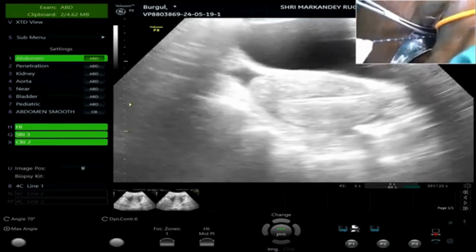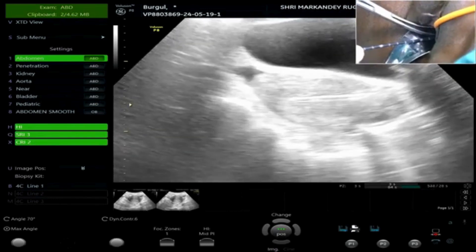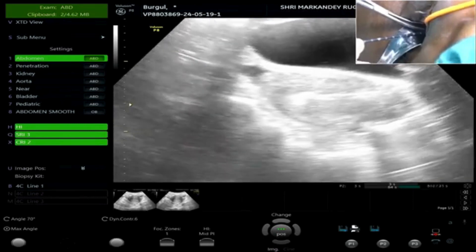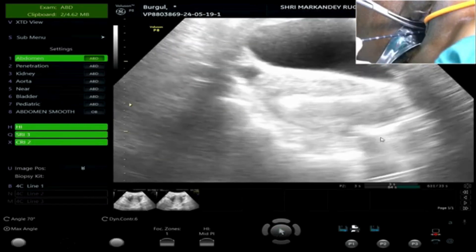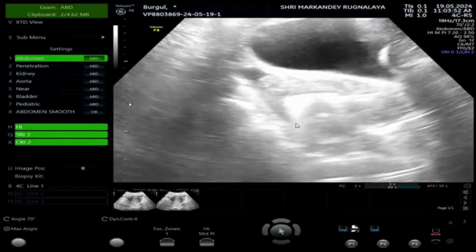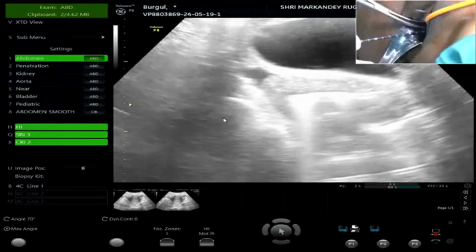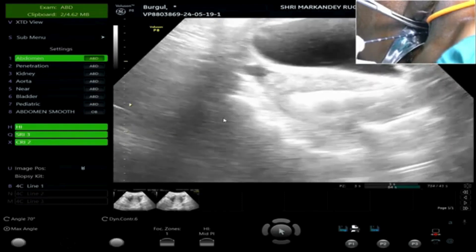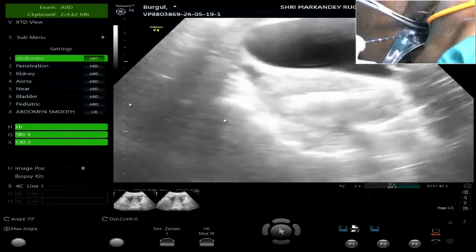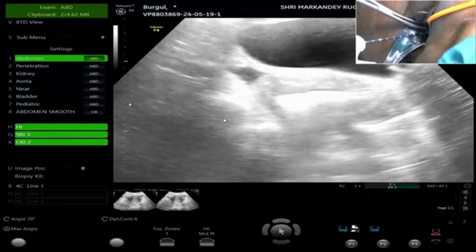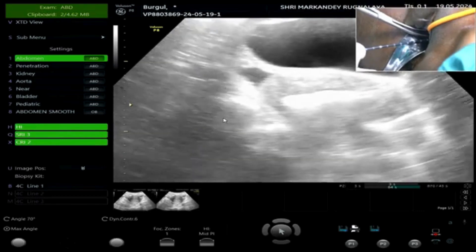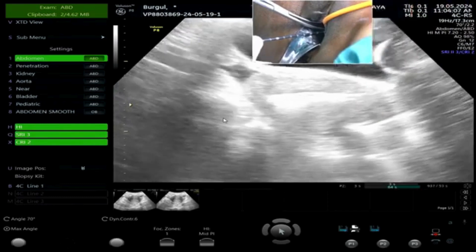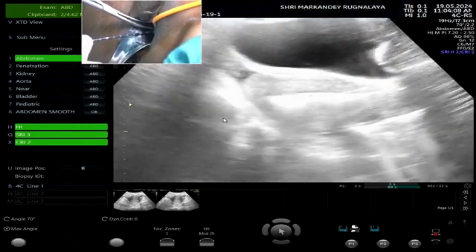You can see the ultrasound monitor — it is ablating now. That white is spreading. This is called steaming inside. When releasing hydrogen gases, oxygen inside — disruption of H2O — it causes white. All gas in ultrasound appears white — gasification. So micro bubbling.